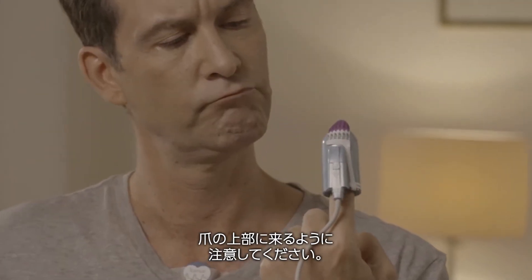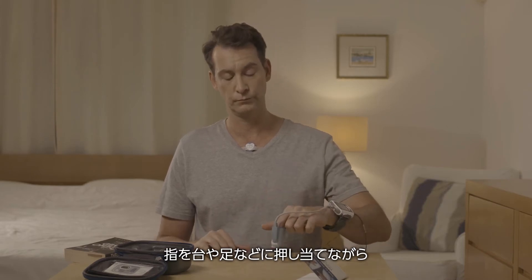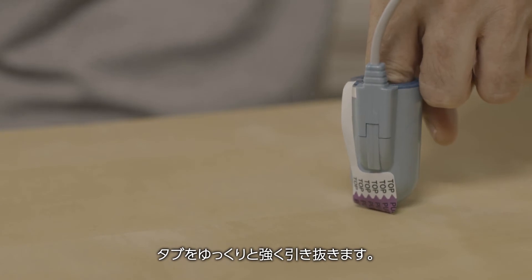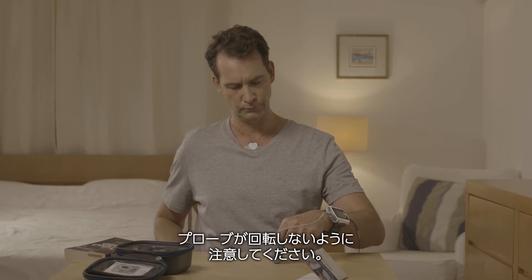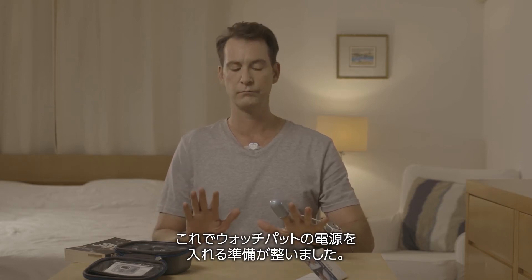While pushing your finger against a surface like a table or your leg, gently and firmly remove the tab. Be careful not to twist the probe. You are now ready to turn the WatchPAD on — get into bed.